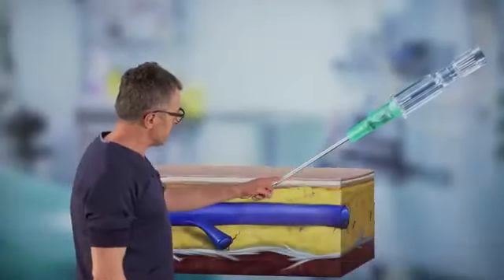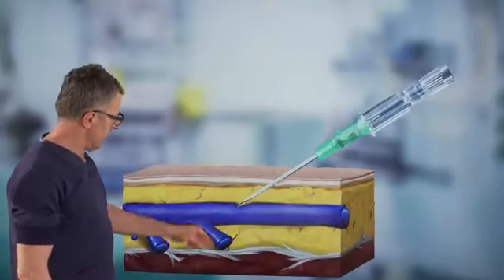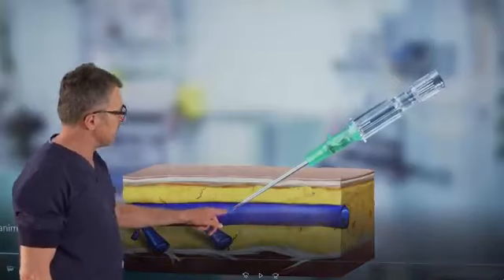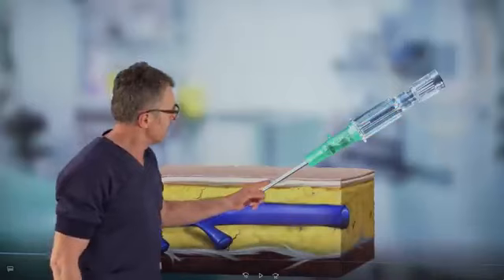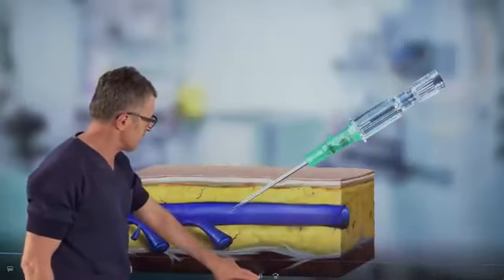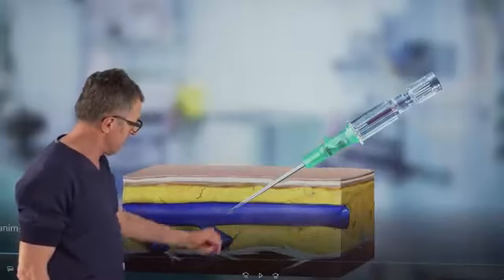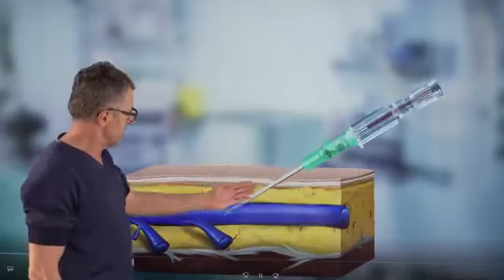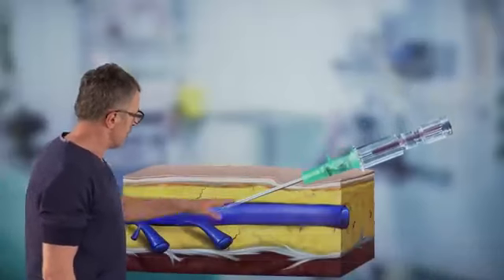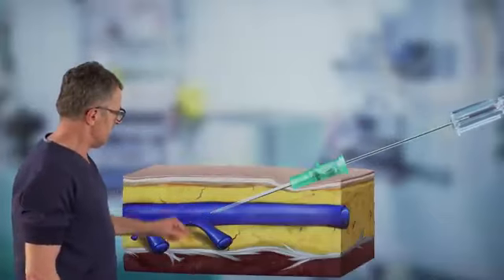So here's the catheter passing through the dermis and edging towards the vein. As soon as the catheter enters the vein, we will immediately see the flashback, as we call it, because the blood will want to go into the expansion chamber, and there it is. So now we know that we're inside the vein. At this point, what we simply do is continue advancing the catheter, lower the angle, and pull the needle out, leaving the catheter inside.